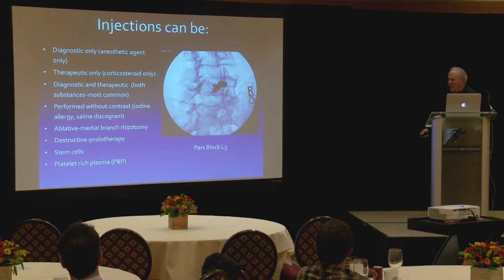And it's important that Dr. Evans be precise, and thank God we have him, because there are guys that are not as precise, unfortunately. So if you have iodine allergy, you can have these blocks performed without contrast, but contrast is helpful for Dr. Evans to see where everything is, and we'll talk about this.